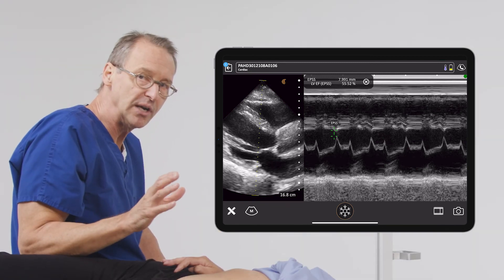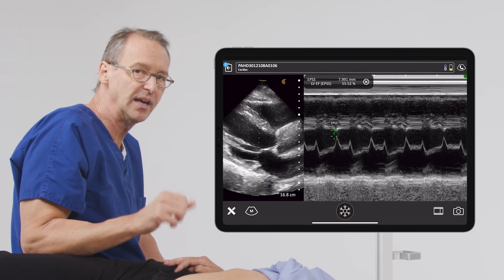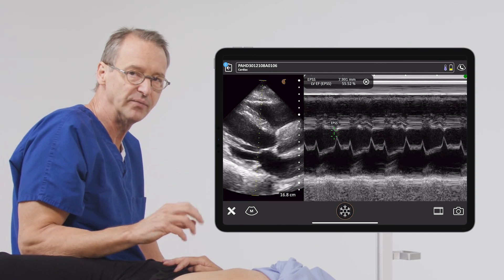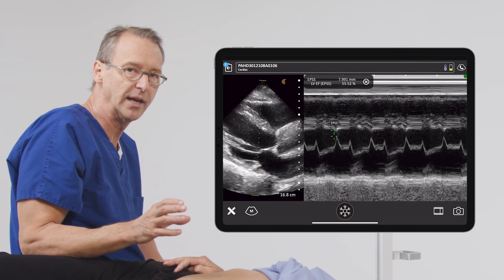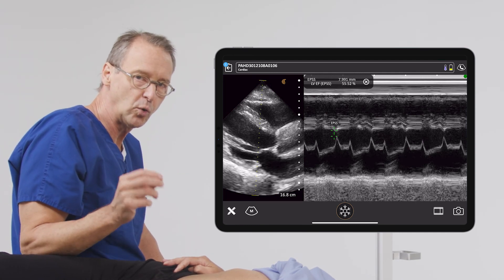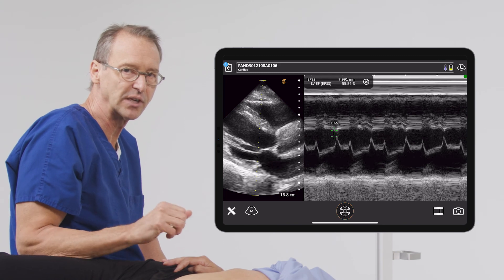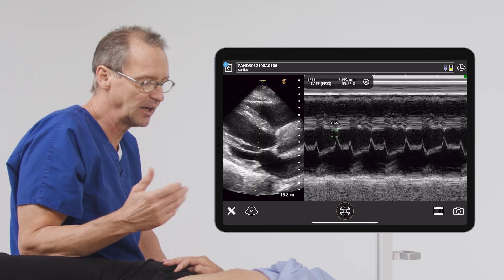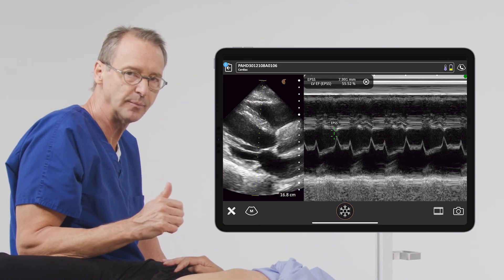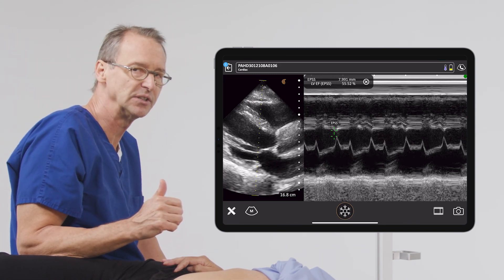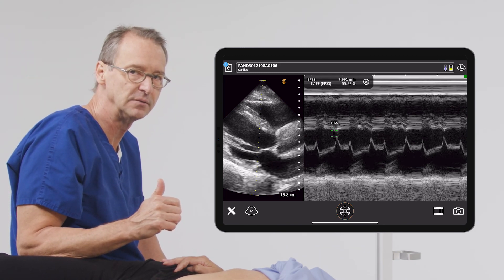In summary, EPSS is a very quick way to quantitatively assess left ventricular function and can be used in a number of different situations at the bedside.